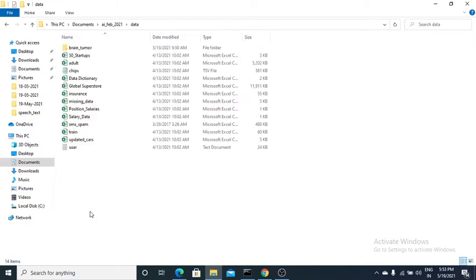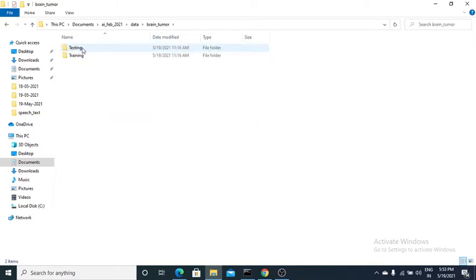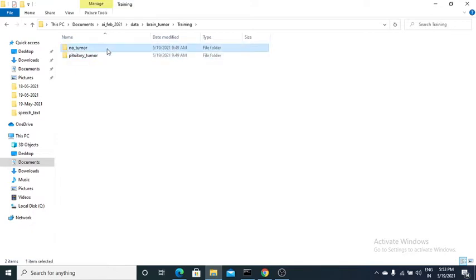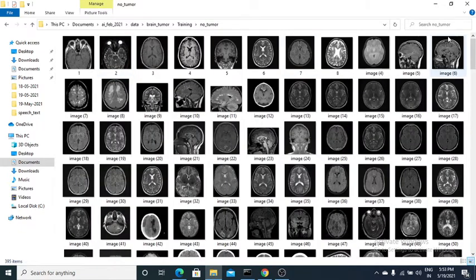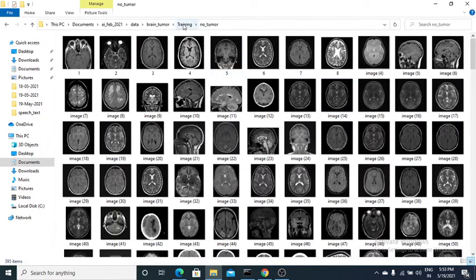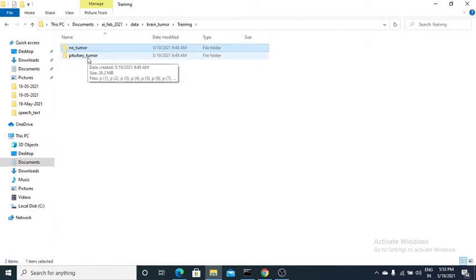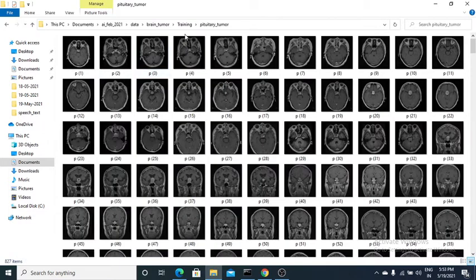Inside the data folder there is a brain tumor folder with two subfolders: testing and training. In training there are two subfolders — no tumor, which has 395 MRI images of patients with no brain tumor, and pituitary tumor, which has 827 total images of patients who had a tumor.